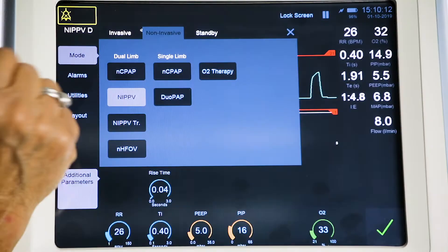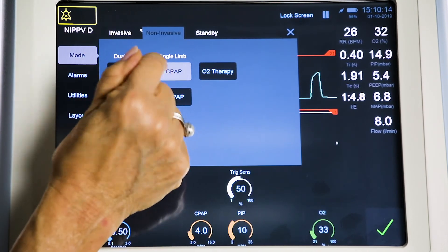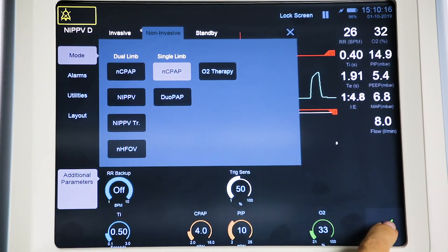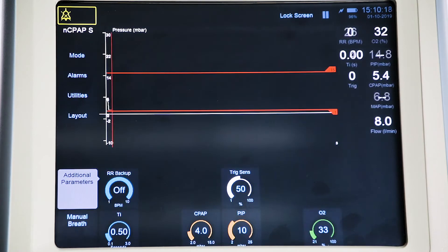NCPAP: Select mode NCPAP. In this mode, the ventilator generates a continuous positive airway pressure at a level set by the user.